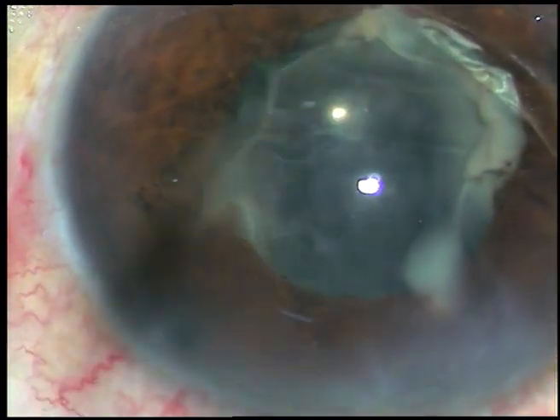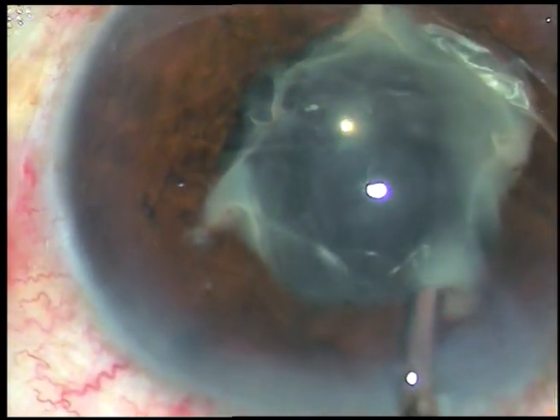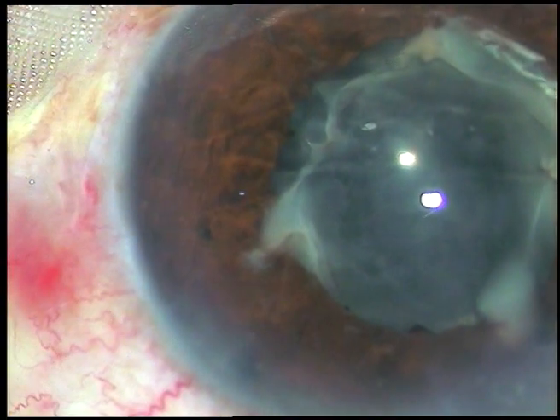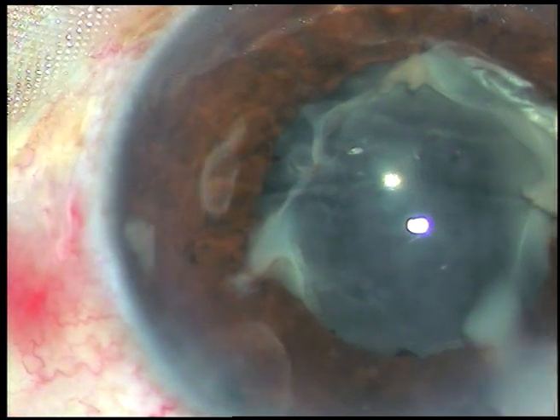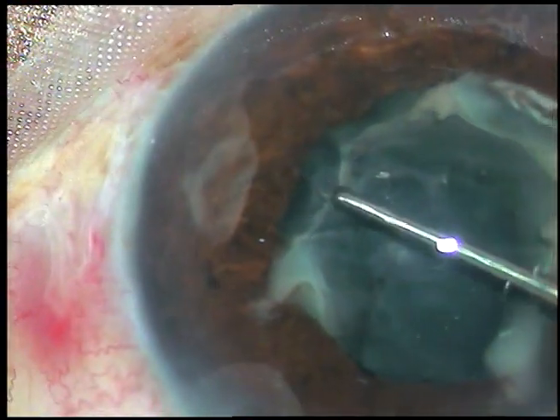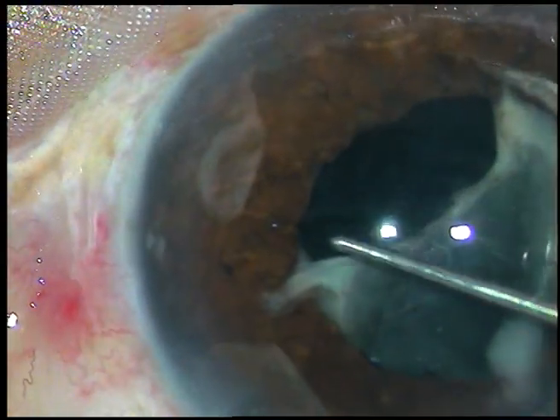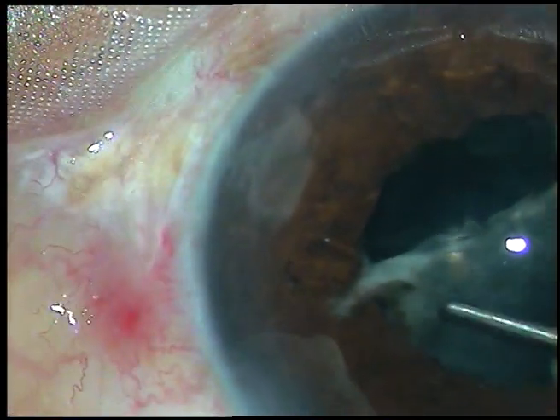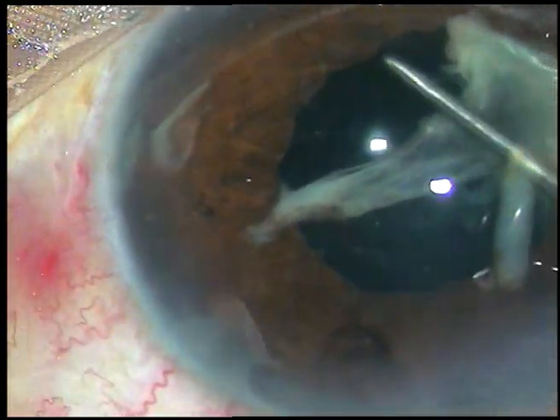So I have to inject viscoelastic substance and take the help of a Sinskey hook to pull this membrane. Viscoelastic has been injected and now a Sinskey hook is being introduced. I am pulling this membrane with the Sinskey hook — see how thick and tough the membrane is.